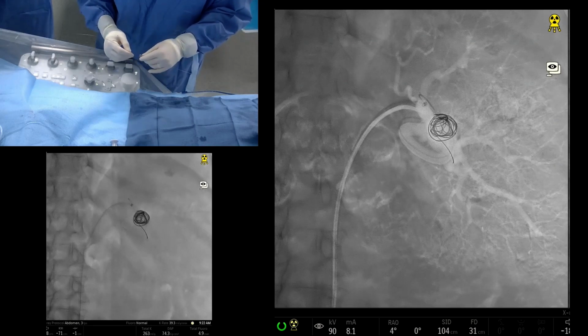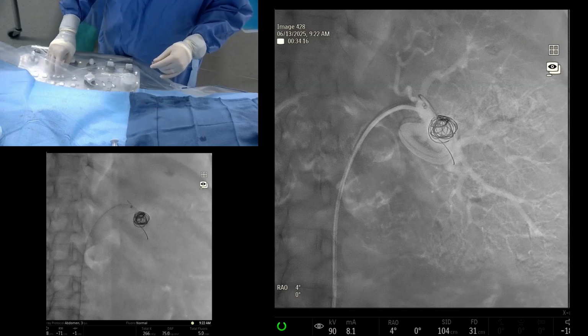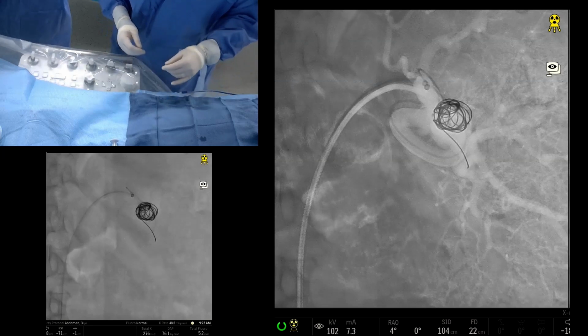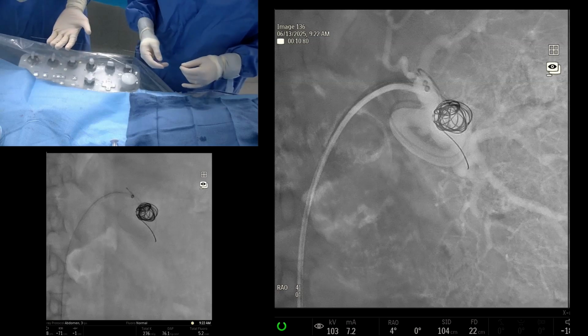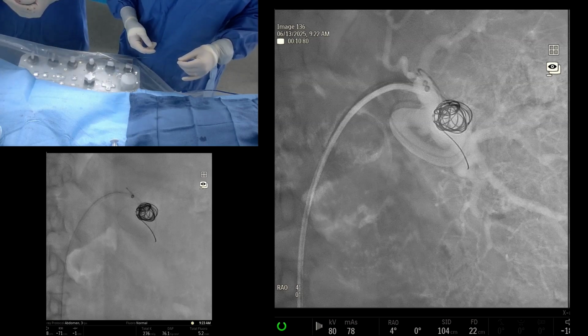Now, it gets a little bit messy here, I will admit, because I've implanted my microcatheter into the aneurysm sac. As we push more of the coil out, it's sometimes quite difficult to see the tip of our microcatheter. Potentially that's why Emil might prefer something like a pushable coil, because that way it's completely out. Here, it's a detachable mechanism. You can still push it out if it's still left in your microcatheter, but the whole point is to position as you see fit, and then ultimately detach it.